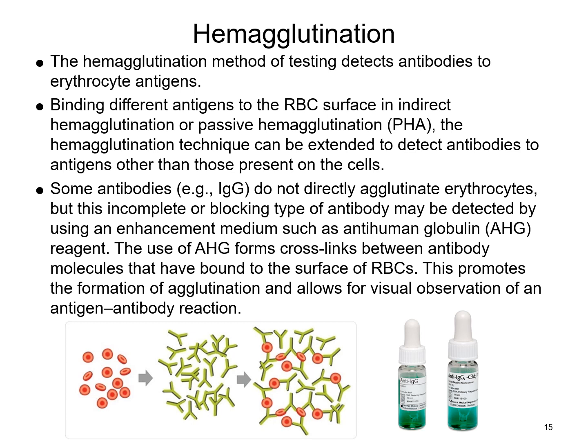Once you add that AHG reagent to your reaction, it's like a second antibody, and it's going to bind to the antibody present on those erythrocytes. We'll talk about this in more detail as we progress through this course, as well as when we go over blood bank. Your diagram here at the bottom shows the agglutination reactions, where the red cells and the antibodies come together and start bridging to form clumps.